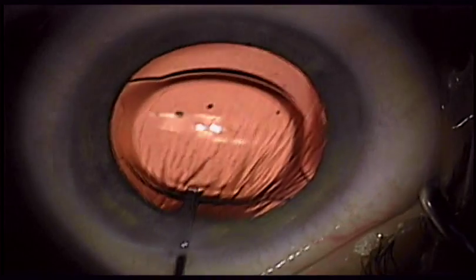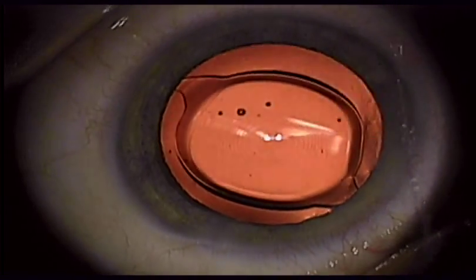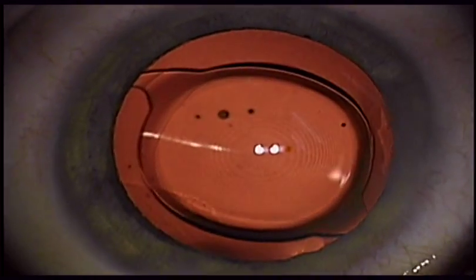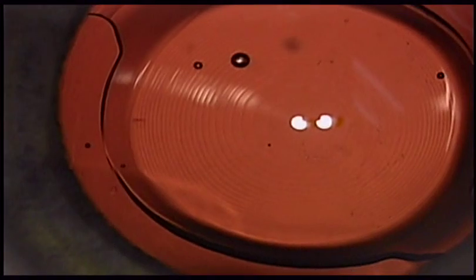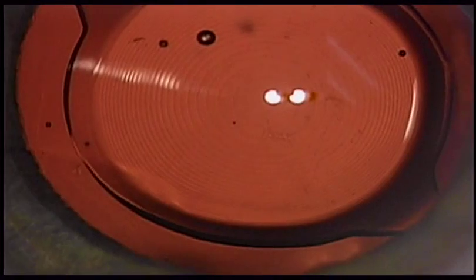This patient had received a regular Tecnus Multifocal in the contralateral eye, and I asked him if there were any differences between this and the other lens. His initial comment was that this eye had been very comfortable from the very onset with no feeling of scratchiness. This may be due to the smaller incision.